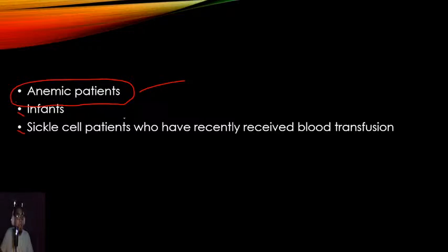You need to get a certain amount of cells from the patient, make a cell suspension using the centrifuged portion of the anemic patient sample.